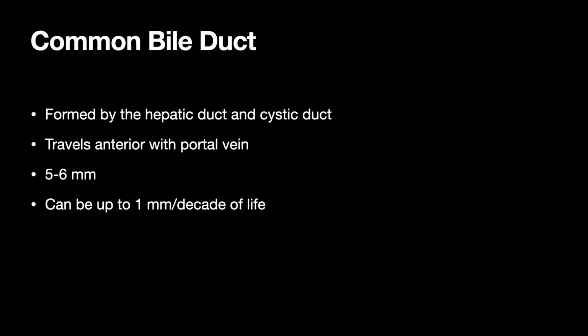It can be less than that. But it can be bigger than that under a couple different conditions, right? Number one is pathologic conditions. So if you obstruct it, it can get big, right? That's the one thing we're worried about. Number two, if you take the gallbladder out, the CBD tends to get a little bit bigger, right? You can see it enlarged there.